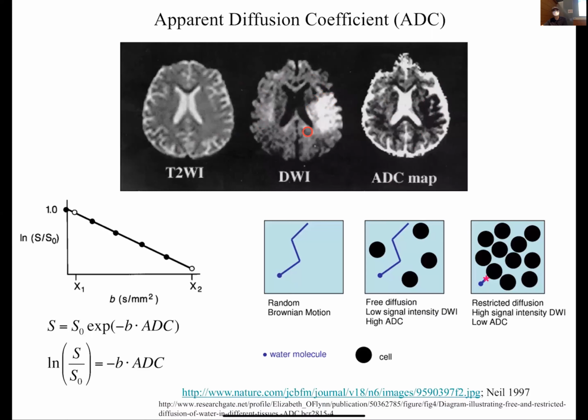So this is the basis of diffusion imaging, and one of the biggest applications is applying it to looking for stroke. So it's still a very standard method. If someone has had a stroke, it turns out that in many cases the diffusion of water goes down. Why that happens is still not known for sure, but when the cells die, if there's, for example, active transport of water, then that transport would be decreased. Maybe the cells are swelling, that's reducing diffusion. But for whatever reason, empirically, people find that diffusion of water just decreases wherever there is cell death.